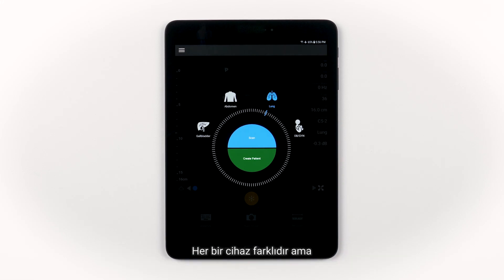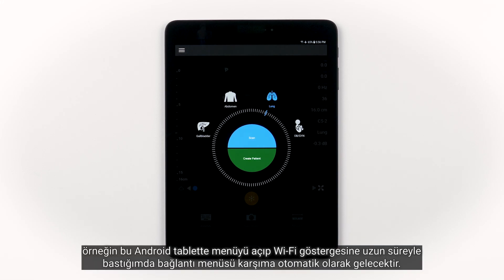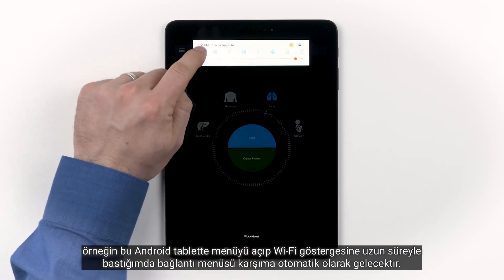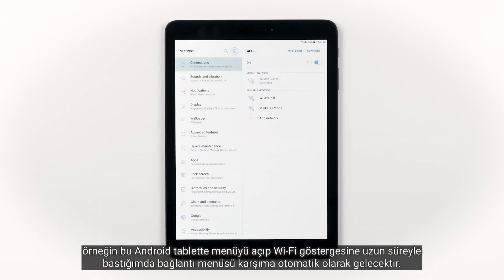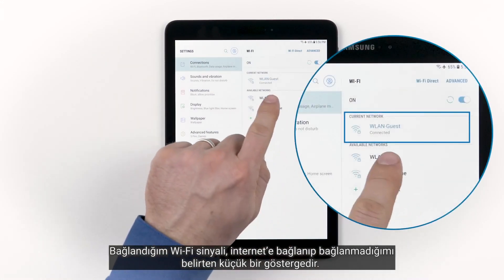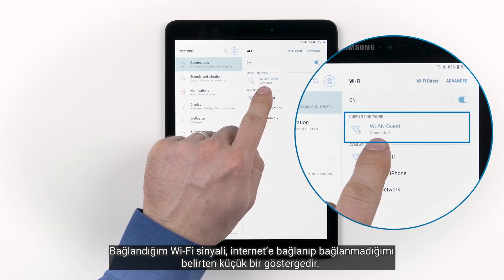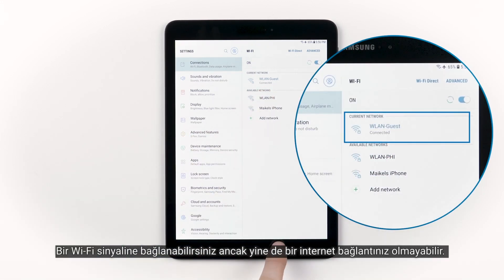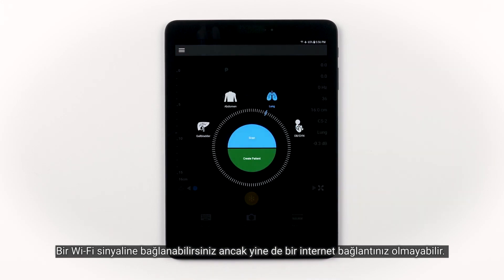Each device is different. But on this Android tablet, for instance, I can open up the menu and long press on the Wi-Fi indicator, and this will bring up my connections menu automatically. The Wi-Fi signal that I'm connected to will give me a little indication saying whether I'm connected to the internet or not. It's important to understand that you can be connected to a Wi-Fi signal and not have an internet connection.